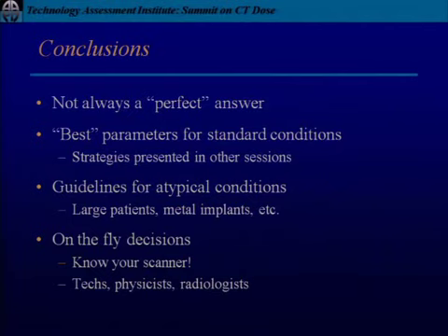And the point about the different collimation choices, with the case of the VCT being 20 or 40, I actually had a slide that I didn't show with one of the older GEs, where it showed all of these different permutations that you had a choice for collimation. So I think that was nice that they are limiting the choices like that for some of the main exams, so the user doesn't have to worry, do I use this collimation or that collimation or this detector?